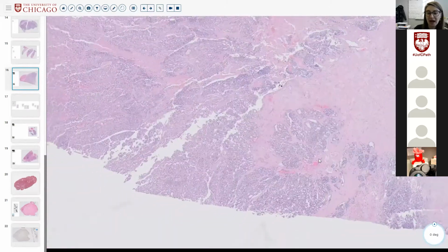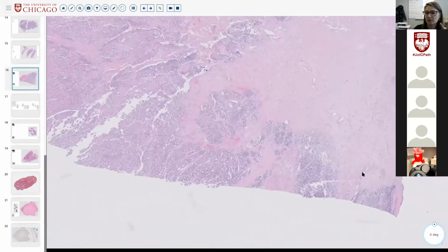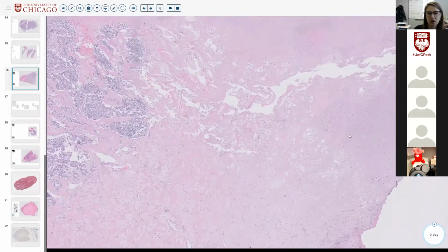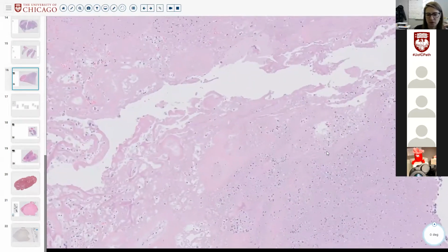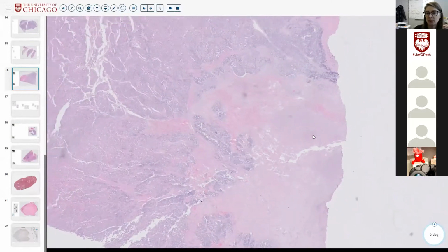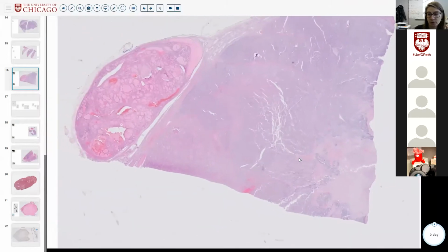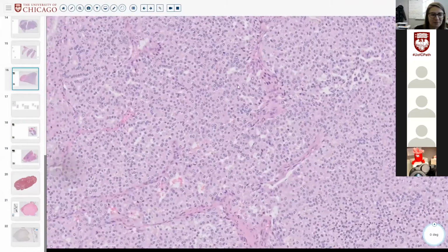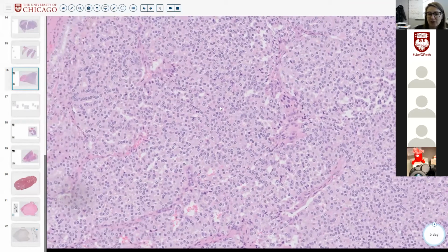And so I'm highly, highly respectful of tumor necrosis in thyroid, because it often can mean something bad. So if you ever see true tumor necrosis, keep submitting, keep sampling. Here we see true tumor necrosis in the background of what is otherwise a quite solid and cellular neoplasm.